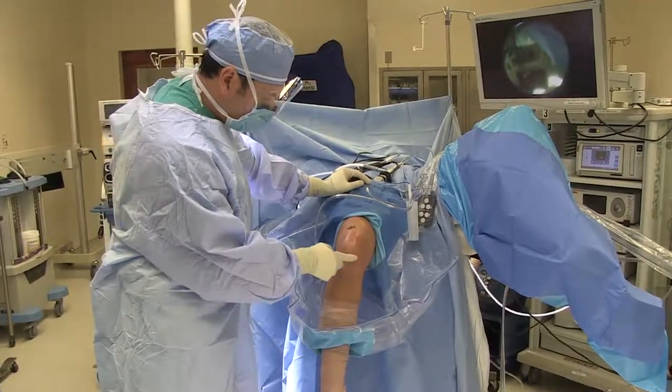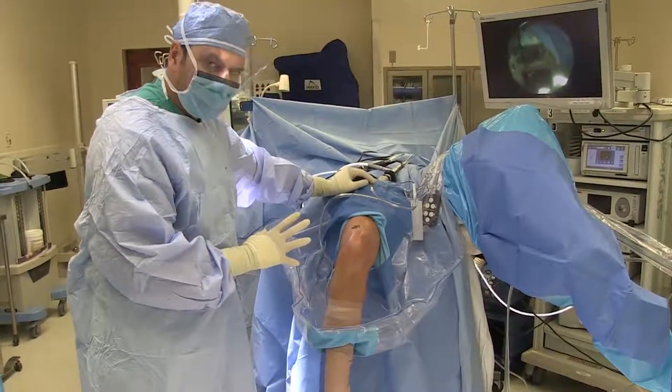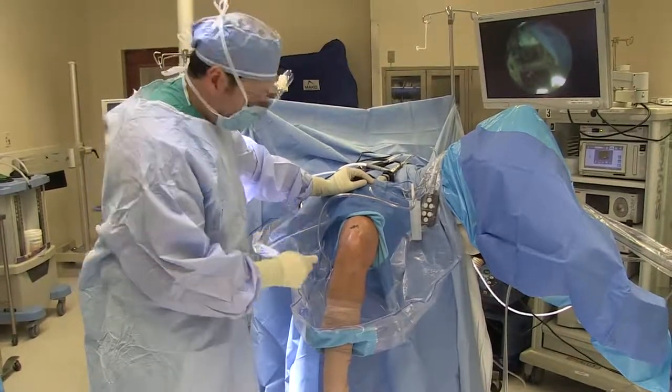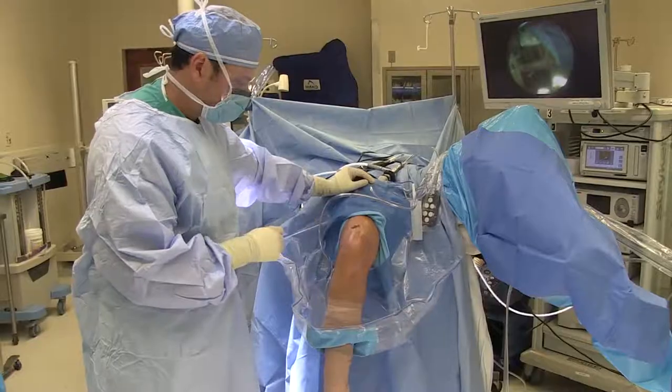Now we are going to perform a cartilage restoration procedure with Prochondrix. What we'll do today is perform an arthroscopy to begin with, evaluate the lesion, clean out the gutters, make sure there are no other significant issues with the knee, make sure it remains a unipolar defect, and then I'll make an arthrotomy around her medial portal. We'll find the lesion and then perform the cartilage restoration procedure with Prochondrix.